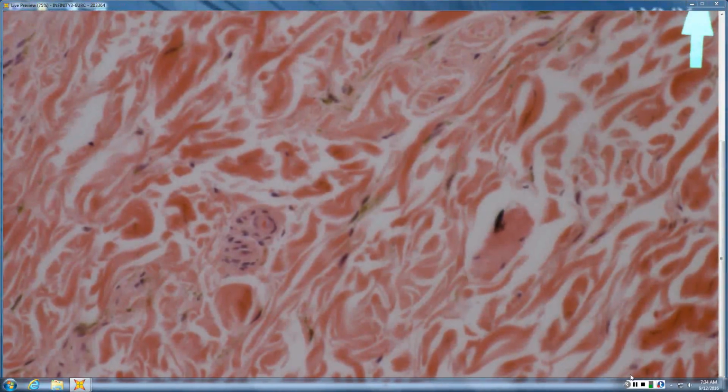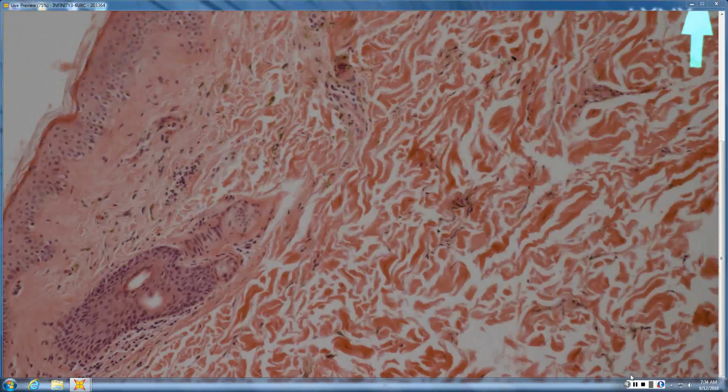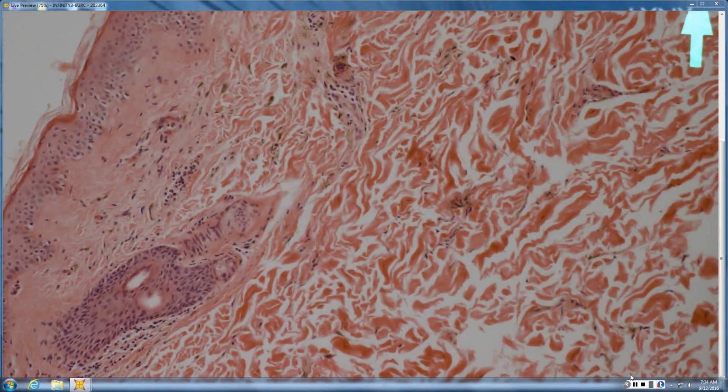Their orientation is parallel to the epidermis, so east to west. So all east-west in orientation, pigmented dendritic cells, and they look like they're mainly in the upper half. Yeah, so they're upper half to third, not so many down deep. So I would think one of the dermal melanoses, like the nevus of Ito or Oda or something like that. Exactly. So nevus of Oda, nevus of Ito, nevus of Hori.